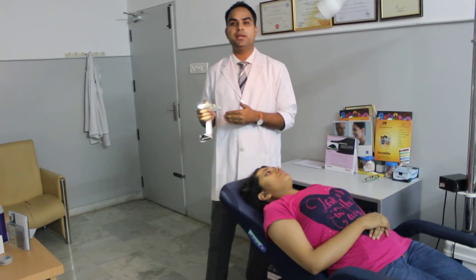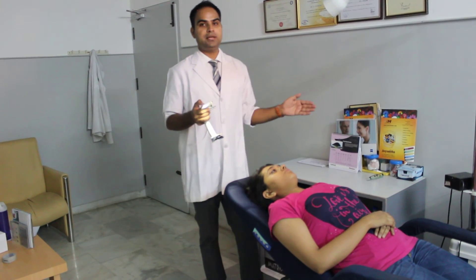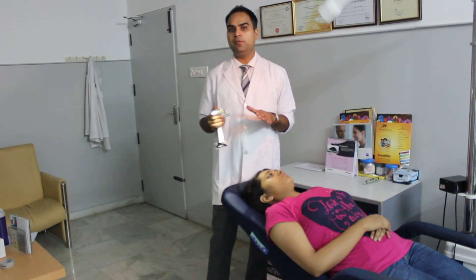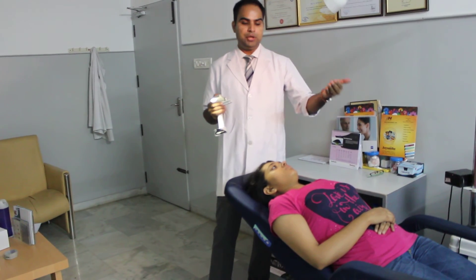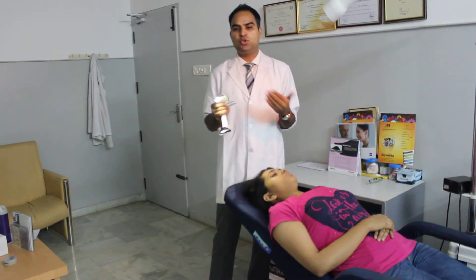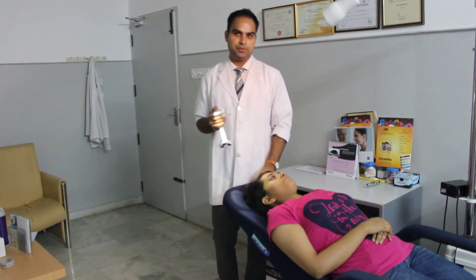This is pretty much the way you scan all areas. For example, if you want to scan the superior area you need to be on the inferior side; if you want to take the nasal area you need to be on the temporal side. Initially you should do the scanning in a lying-down position, but once you are a little habitual with scanning, you can do it in the sitting position as well. Thank you.